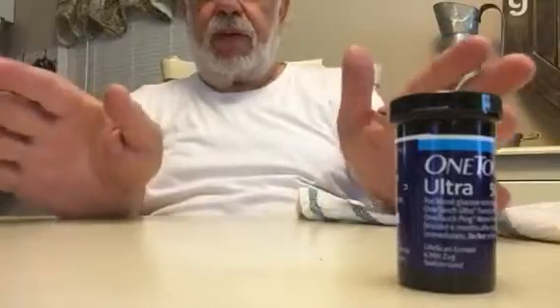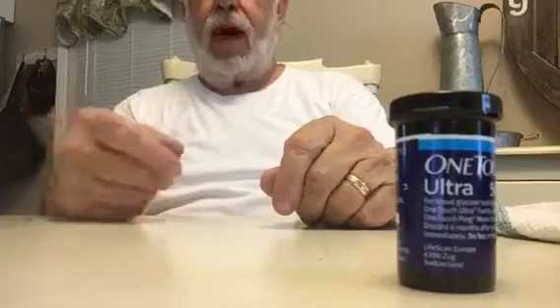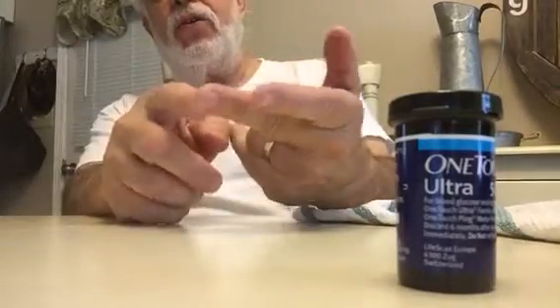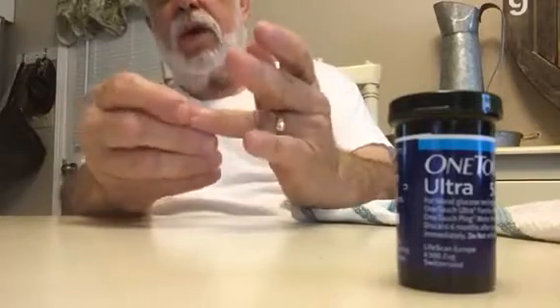If you're testing every day, I use a simple system: I've numbered my fingers to correspond to each day. So this is Monday, Tuesday, Wednesday, Thursday, Friday, Saturday. All I have to know is the day of the week and I know which finger to use. For Sunday I'll do a different position on that finger.